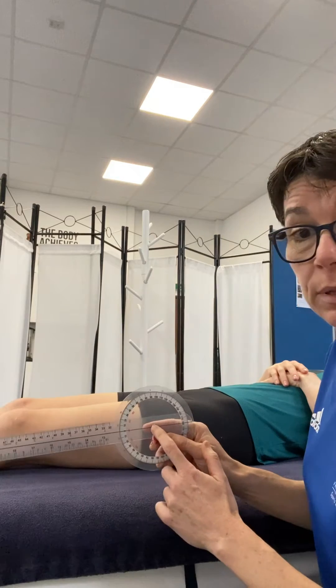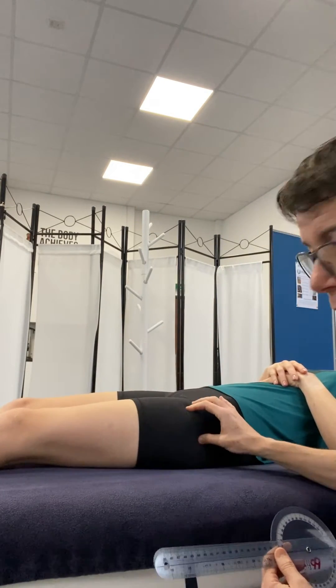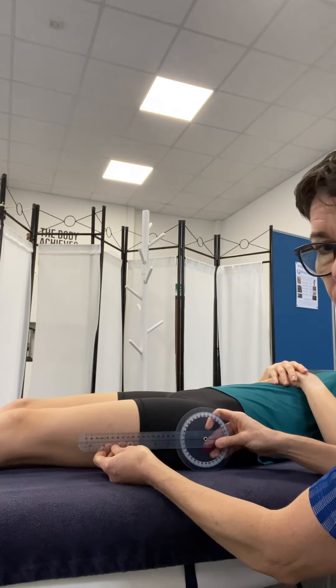For our goniometer placement, the centre of the goniometer goes through the greater trochanter, so have a little palpation of that point. That's our starting position.